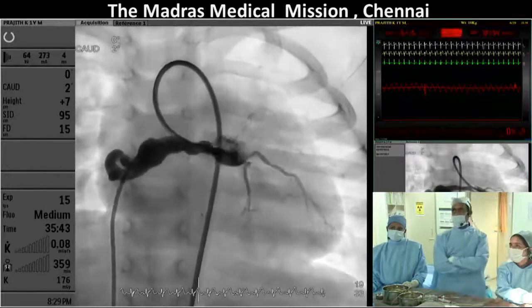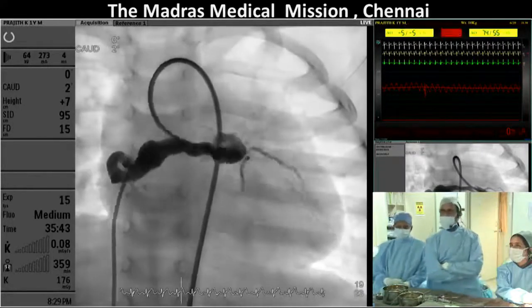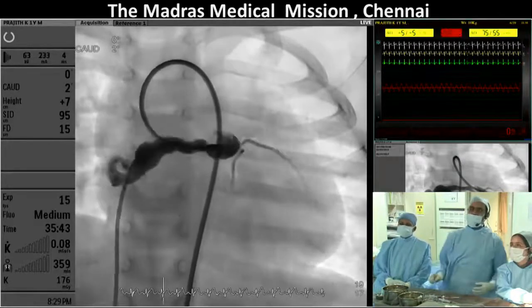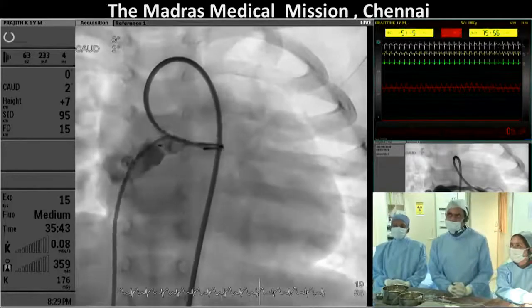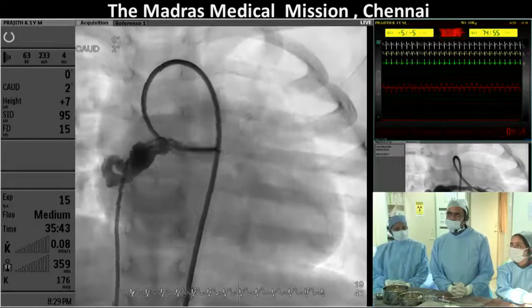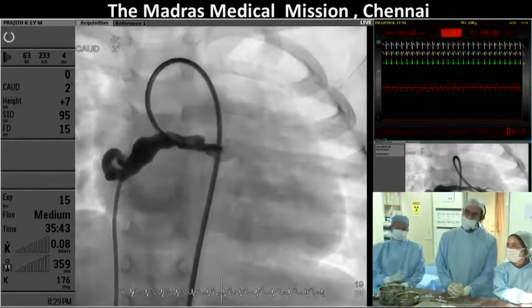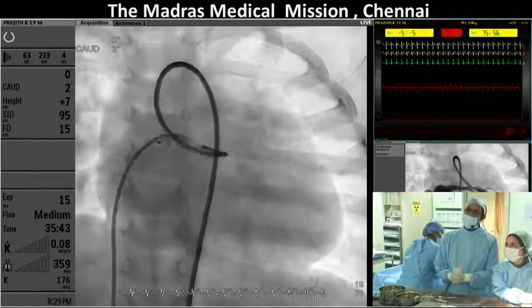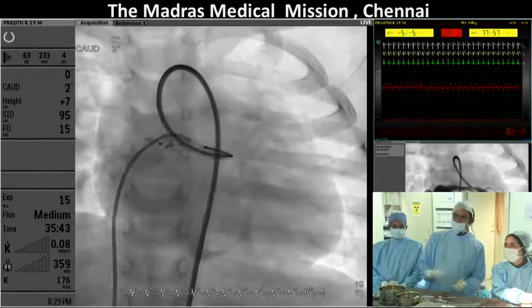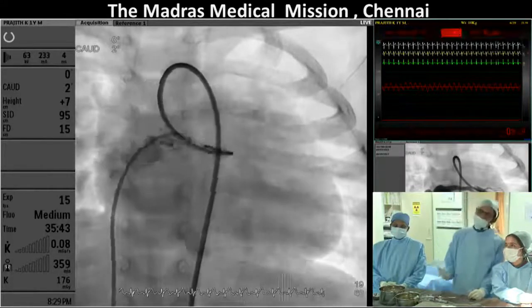Okay, so have a look at that. So wherever that branch was, it ain't there now, yeah? The branch is possibly distal. The position of the plug looks fine. We have got a small redundant sac in front of the plug between the circumflex artery and the plug. But I think to come too proximal will be a little riskier. I might pull out into the aorta.